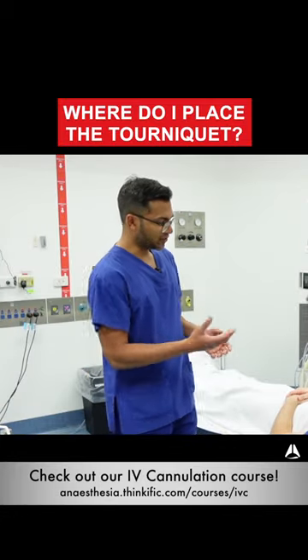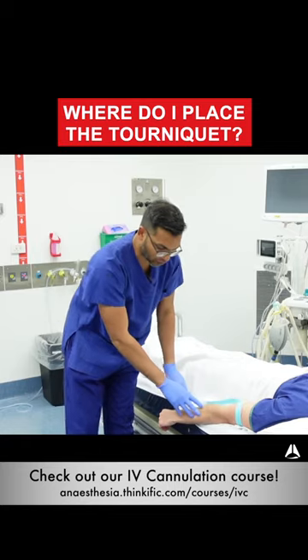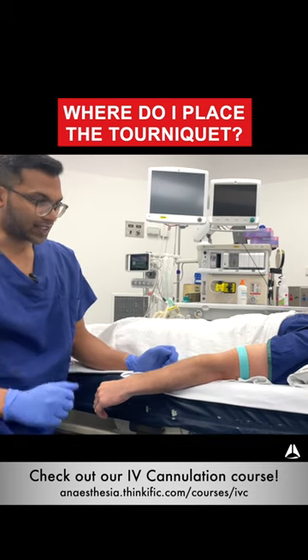Most of the time, you're gonna be asked to choose a vein on the arm. The tourniquet I generally put on the arm and not the forearm. That way I've got exposure completely all the way up and down from the arm, forearm, as well as the hand.